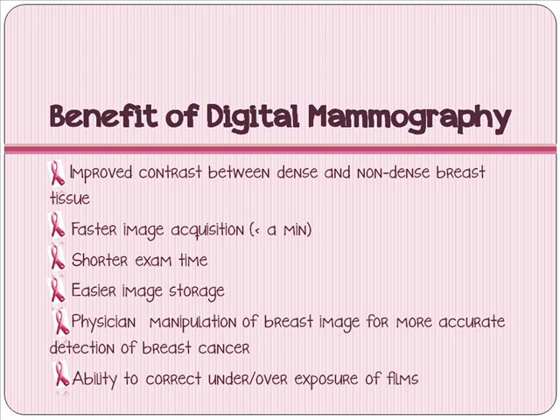This is because with digital mammography, the brightness, orientation, contrast, and magnification of the image may be changed after the examination, and it helps the radiologist to view an image of a certain area more clearly. Digital mammography also has the ability to correct under or overexposure of film without having to repeat the mammogram.